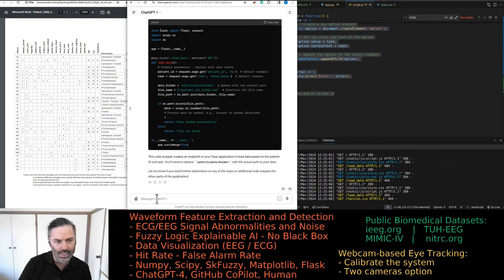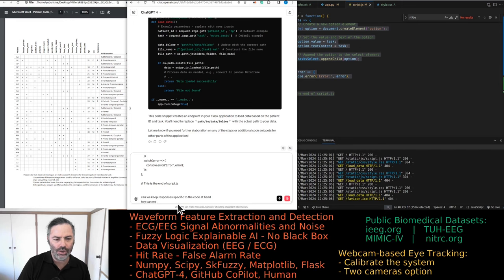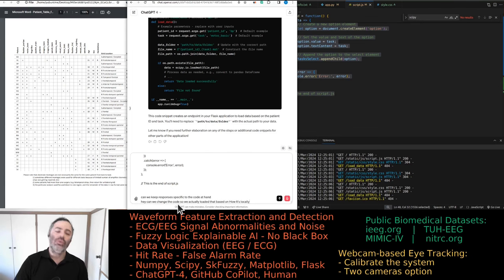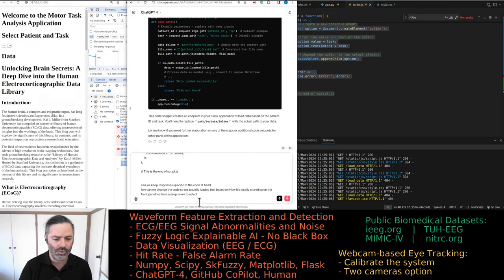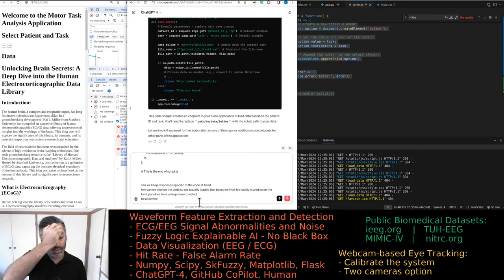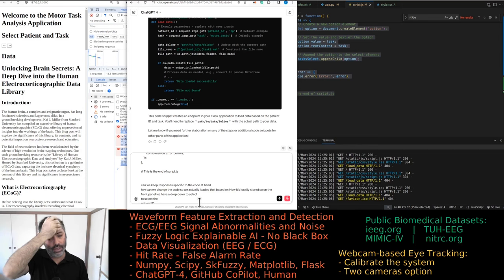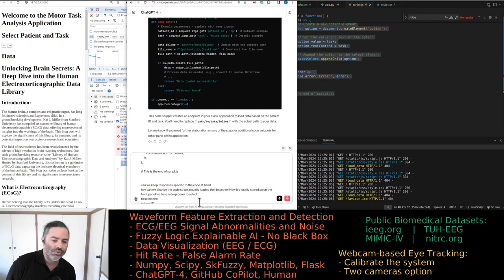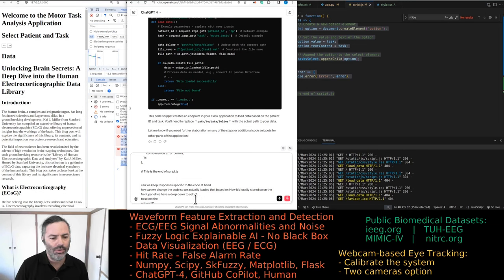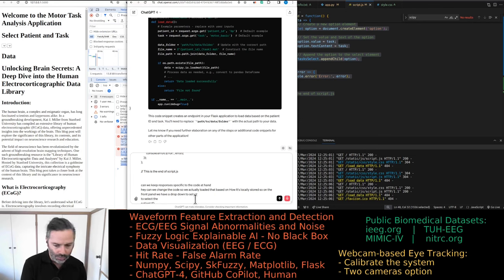Can we change the code so we actually load the data based on how it's locally stored? On the front panel we have a dropdown to select the patient ID. Once you have the patient ID, the code should update the tasks that were performed by that specific patient. Then we have a dropdown for the task that should again be updated for each patient.